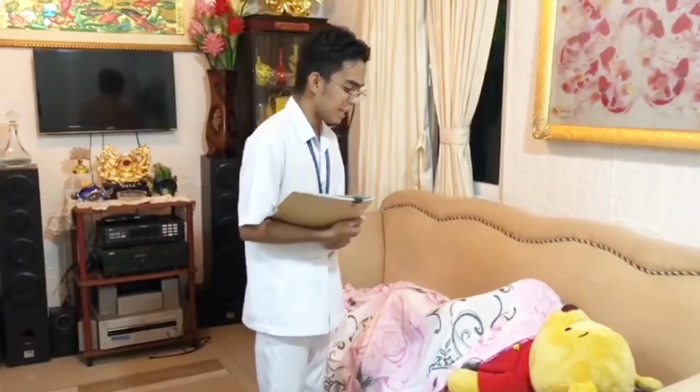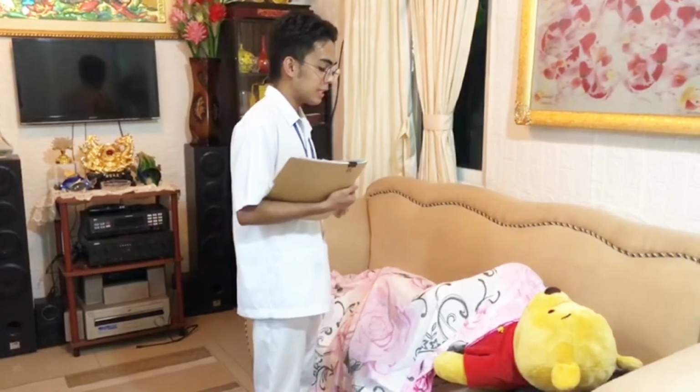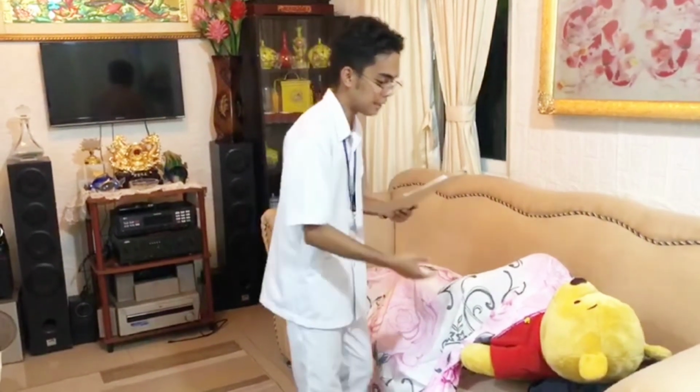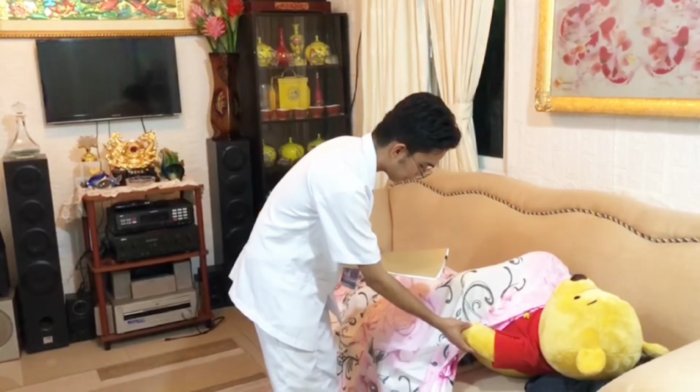Hello, sir. Good day. I am James Andre, your student nurse for today. And for today, sir, since you cannot take the drug orally, we are going to give the medication via subcutaneous injection. Okay, sir? But before anything else, sir, can you please tell me your name, your age and birth date?